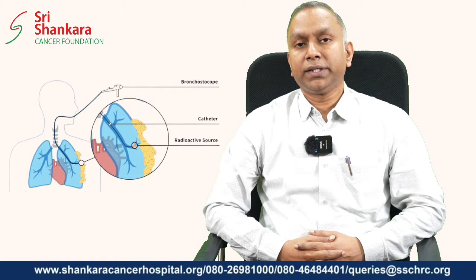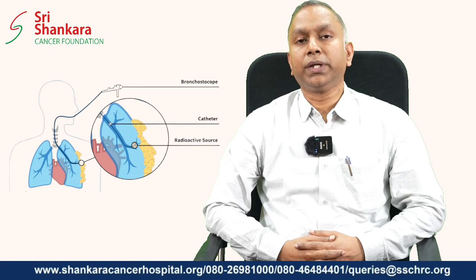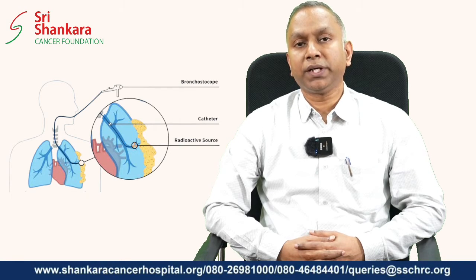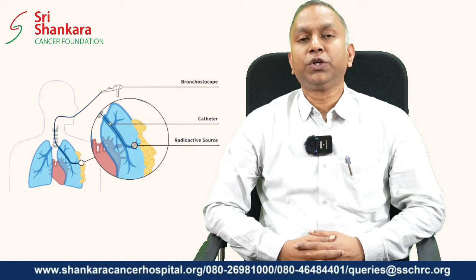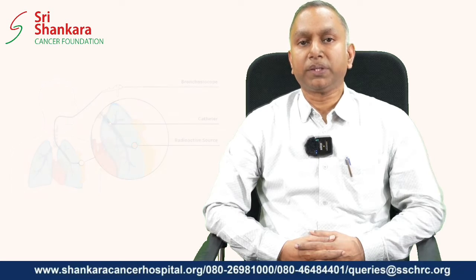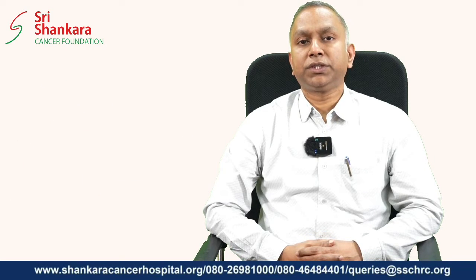In internal radiation or brachytherapy, the radioactive substances are placed in close vicinity of the tumor, and the radiation can be delivered very precisely to the tumor area that we want. Brachytherapy means in close relation to the tumor.